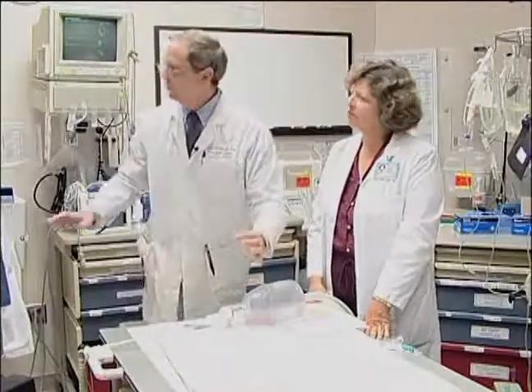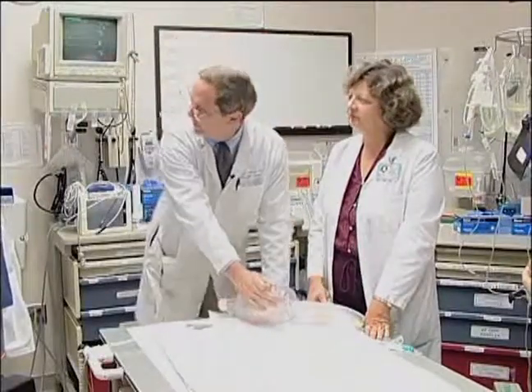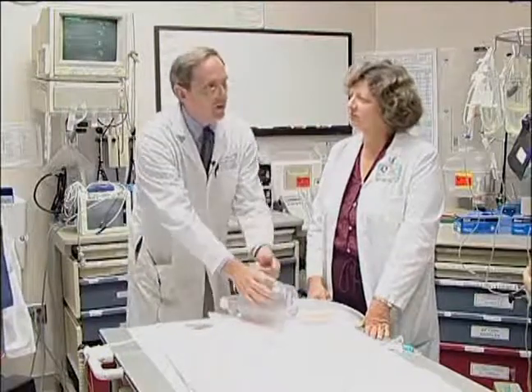But Doc 1, and you need to watch this, should never let go of the endotracheal tube, and often does, because they're doing so much here. You've got to keep an eye on that tube. If you see Doc 1 takes their hands off the tube, get your hand on the tube and on the face so that that thing doesn't go anywhere, and just hold that, and then we'll go ahead and secure it with your assistance. Now, if you're the one that applied cricoid pressure, look up at Doc 1 and say, can I take it off now? Why not? Just get a reaffirmation of that if you're the one holding cricoid pressure.